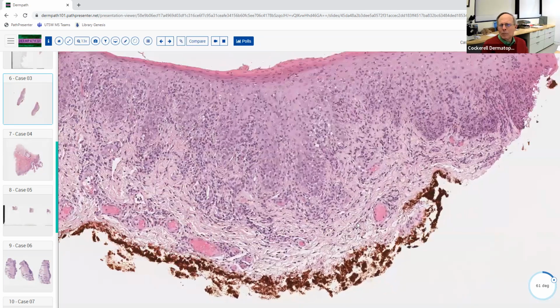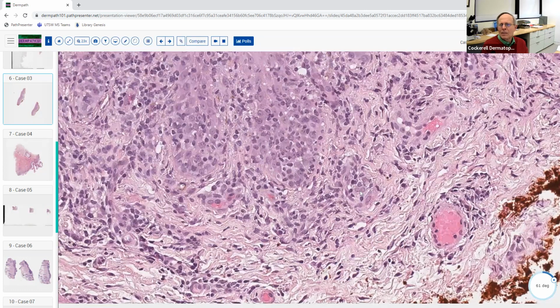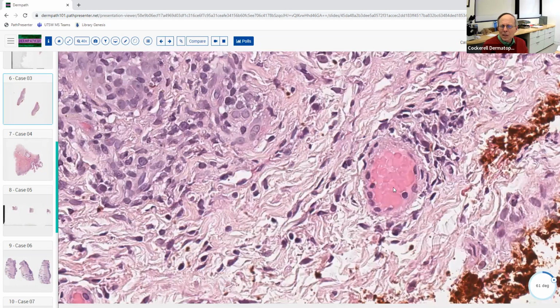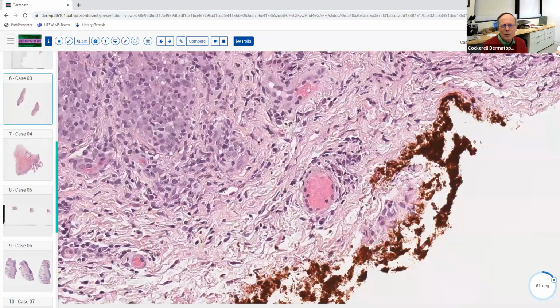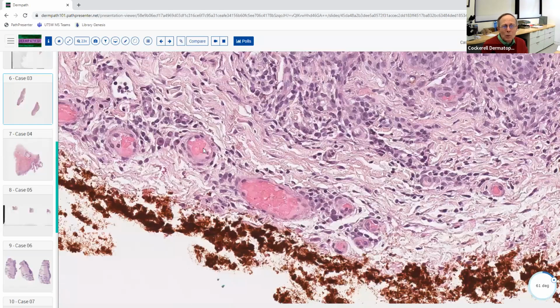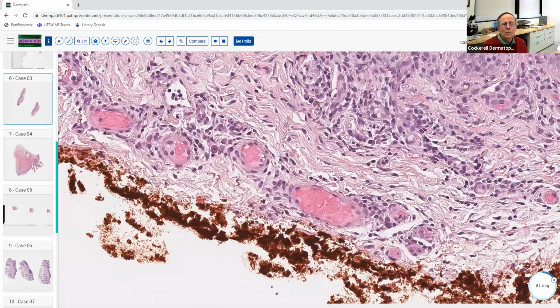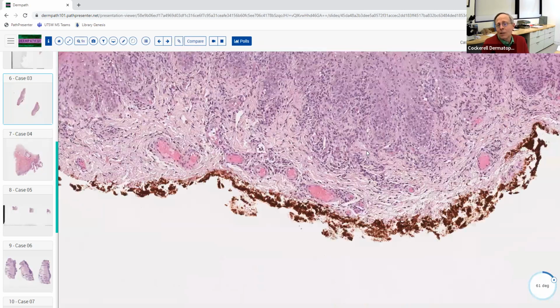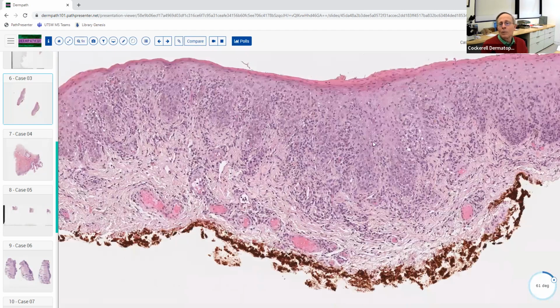The other thing that the textbooks talk about that I don't recommend spending a lot of energy on is that you get these thick, prominent endothelial cells in syphilis. I personally have never used that as a criterion for diagnosis. I don't know that it really is valuable. Maybe that's why these red cells are sludging in here, but I just don't know. Maybe the spirochetes like the vessels too, but most of the time when you do a Treponema pallidum stain, they're located in the epidermis the majority of the time.